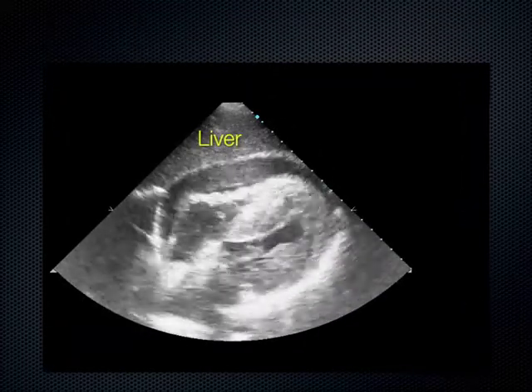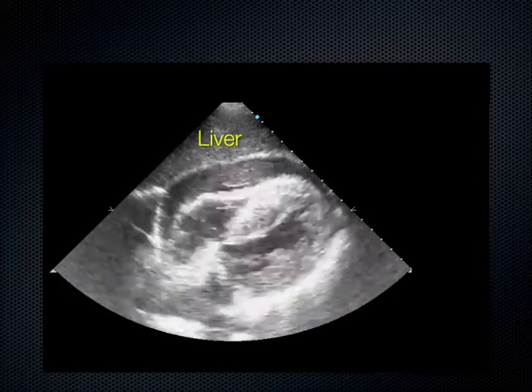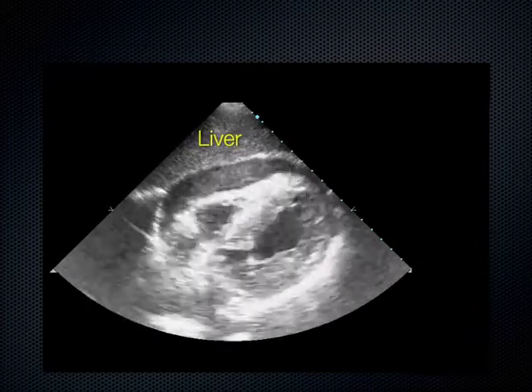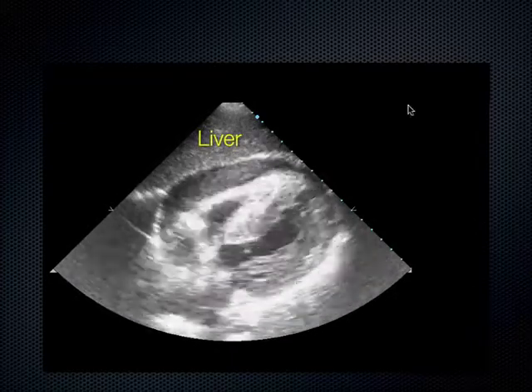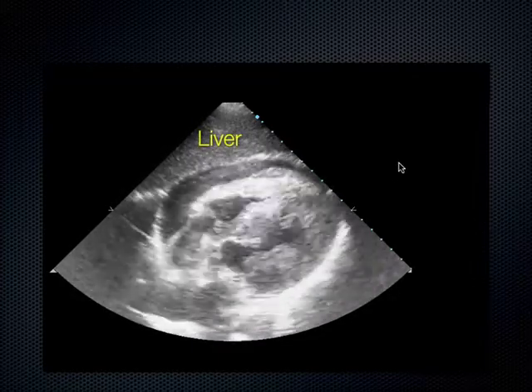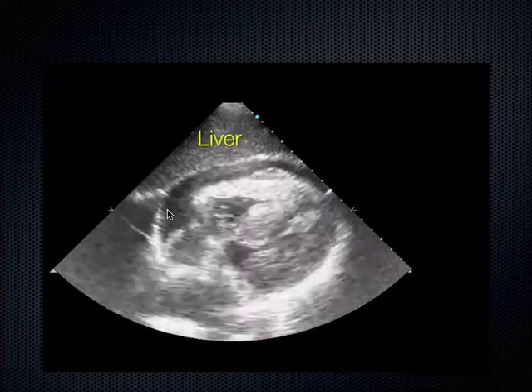Now this is an interesting case here. What view of the heart is this? Same, subxiphoid view. And what do you think about this overall? Yeah, so it's pretty thick in interventricular septum. Okay, I see that, definitely. What else? Yep, so absolutely, you're all saying the right things.